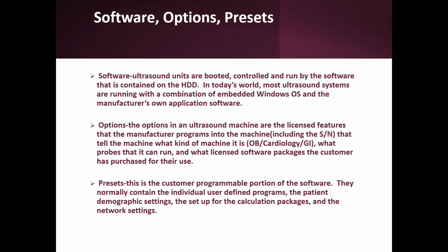Then the presets are the customer programmable portion of the software. They normally contain the individual user-defined programs, patient demographic settings, setup for the calculation packages, and the network.